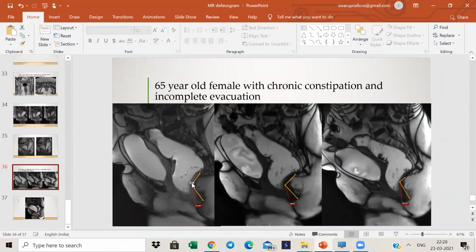Look at a change in the curvature of the anorectum. So basically, you have the rectum, which is located more posteriorly like this. It takes a more abrupt change in the curvature and then tends to slope downwards and anteriorly. Also, the other clue, of course, is a more capacious looking rectum and a relatively narrowed anal canal. So wherever you would see the interface between those two structures, that would be the anorectal junction.